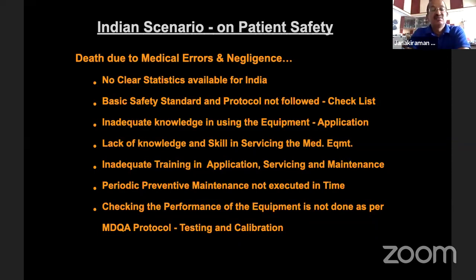Checking the performance of the medical equipment is not done as per MDQA protocol. MDQA is Medical Device Quality Assurance Protocol, which is part of the testing and calibration. And we have a separate presentation for this.